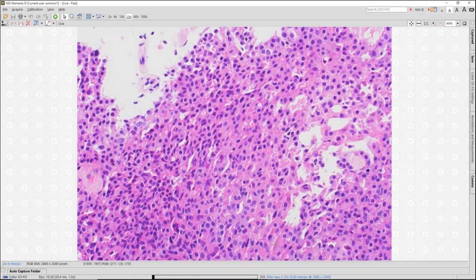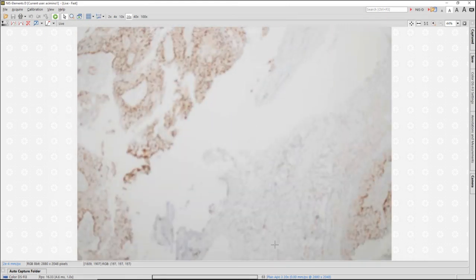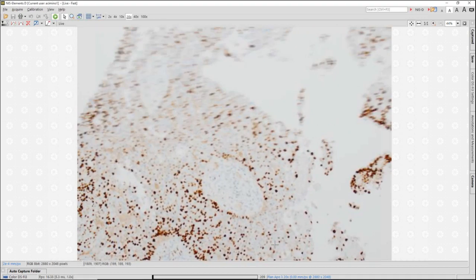and this holds true whether you're in an intraductal papilloma or in a lesion outside of a papilloma. We'll often use a combination of ER and CK5/6 to help us when we're not entirely sure if a lesion is usual hyperplasia or atypical. In usual hyperplasia, the cells show just patchy labeling for ER.